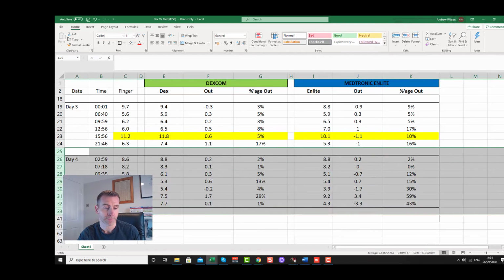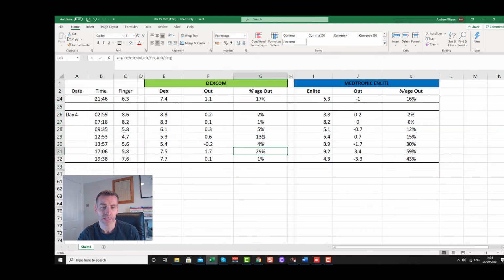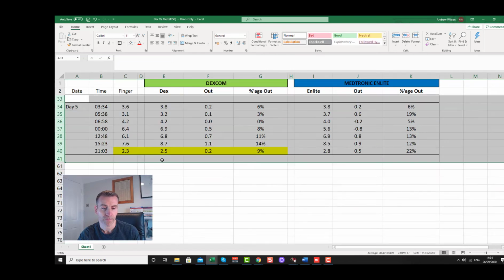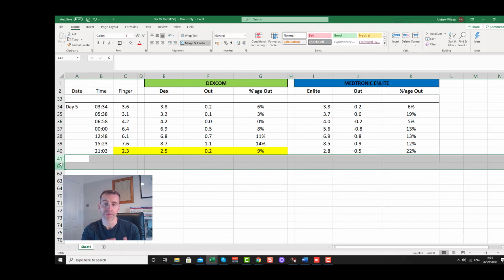Then we look at Thursday. Percentages aren't too bad. There are some strange ones here and there that just arise. And here's the hypoglycemic. 2.3, 2.5, 9% out, whereas the Medtronic was 22% out. That's pretty good, isn't it? It's good to see. And for those of you that are worried about having high blood glucose, and I know I really don't like having high blood glucose, I like to know that it's accurate. So that gave me some confidence with that.